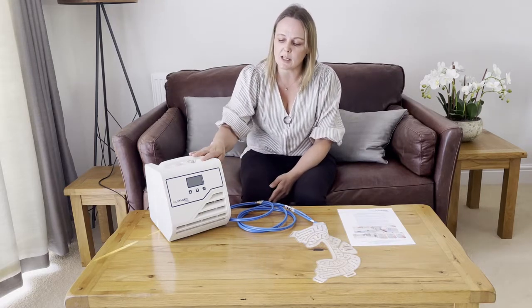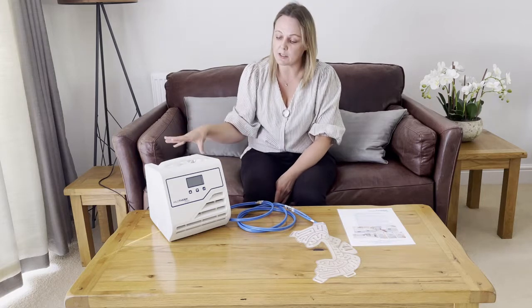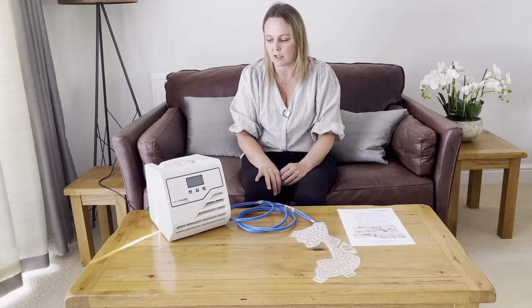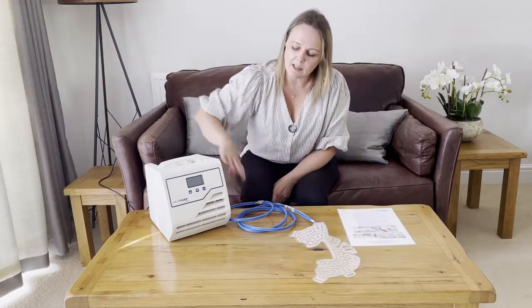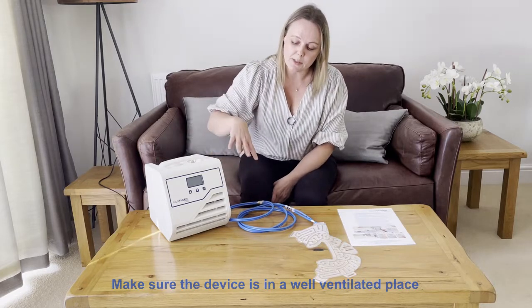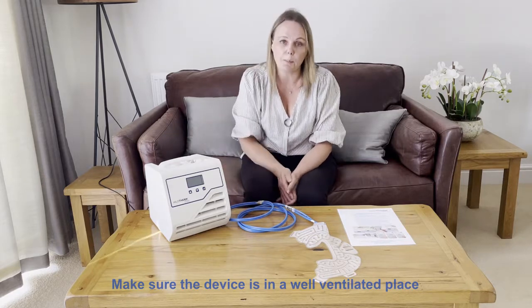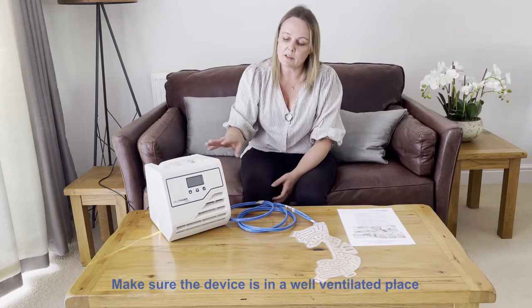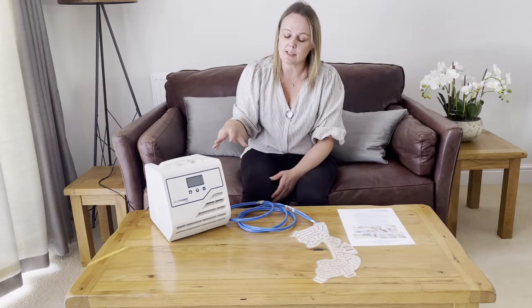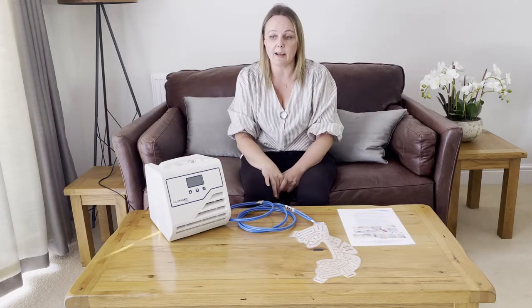Start by placing the device on a flat, stable surface. It needs to be plugged into the power supply and positioned near to where the patient is sitting or lying. One of the key things is to make sure you have plenty of ventilation all the way around the machine — it needs a good 20 to 30 centimetres on each side and also needs to be placed off the floor. The device draws air in and pushes air out, so ventilation is essential to the cooling.